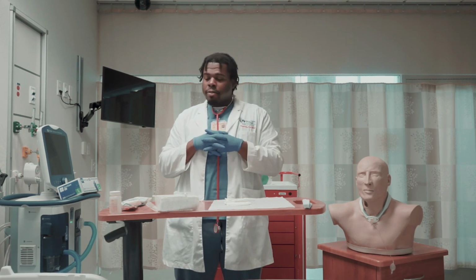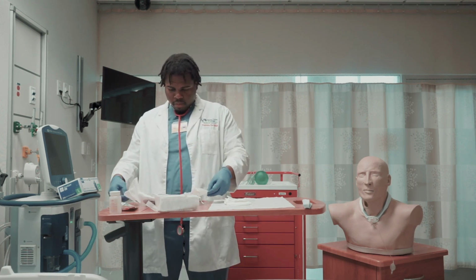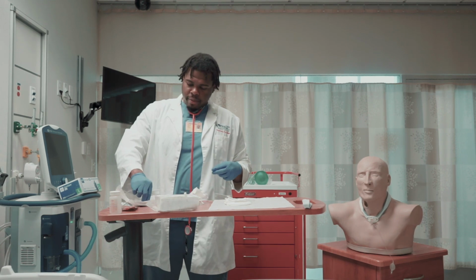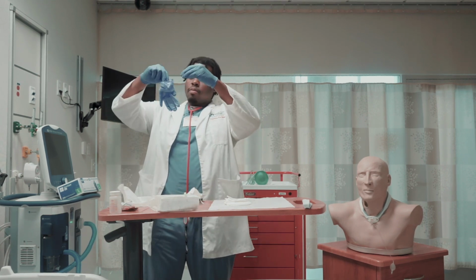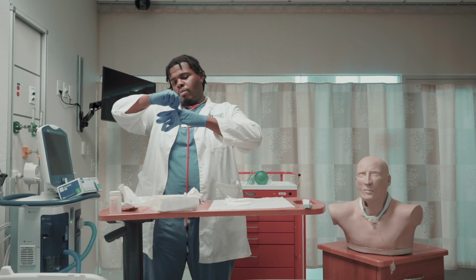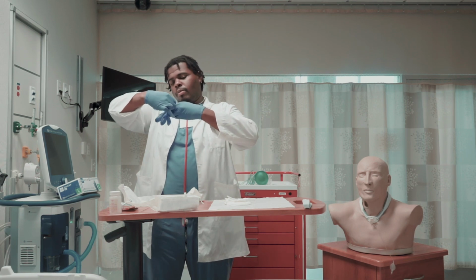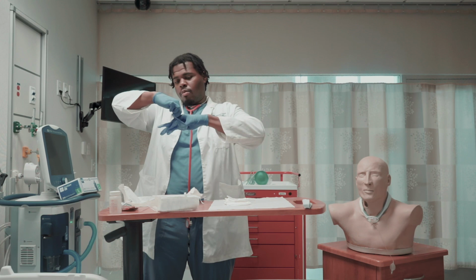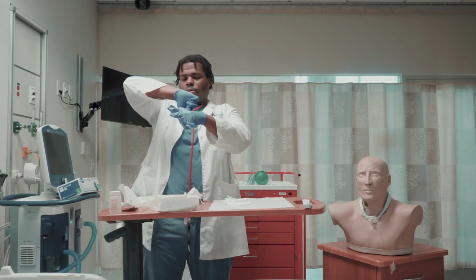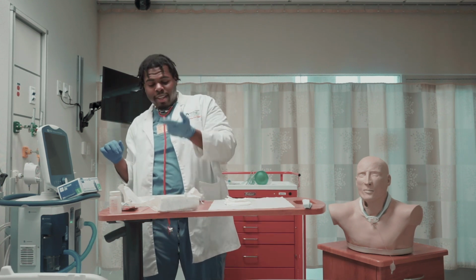Now I'm going to put on my sterile gloves. Grab it by the cuff. Now use your clean hand to scoop the other glove.